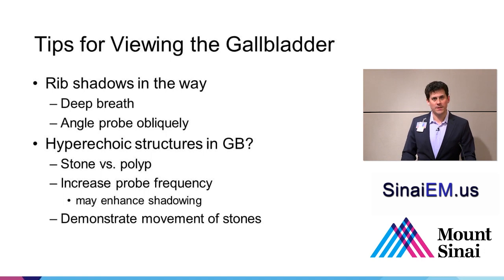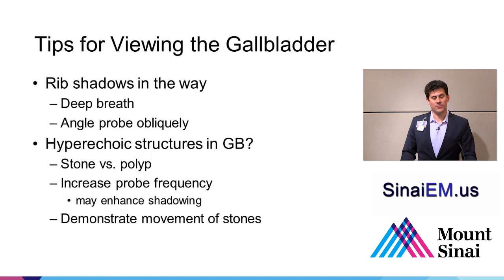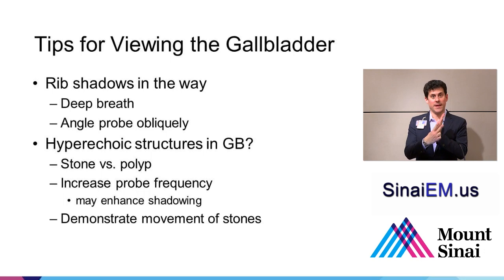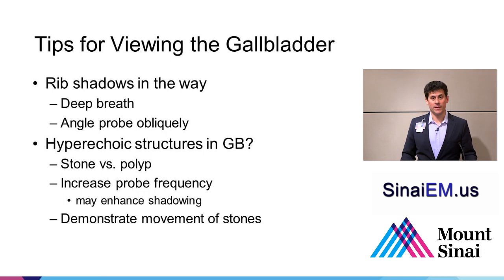Let's stop and talk about a couple of tips for viewing the gallbladder. If rib shadows are in the way, the patient can take a deep breath — that'll push the diaphragm down and bring the liver and hopefully the gallbladder below the costal margin. You can also angle the probe more obliquely so the angle of the ultrasound beam is parallel to the angle of the ribs, opening up more rib space and getting more ultrasound energy in between the ribs.